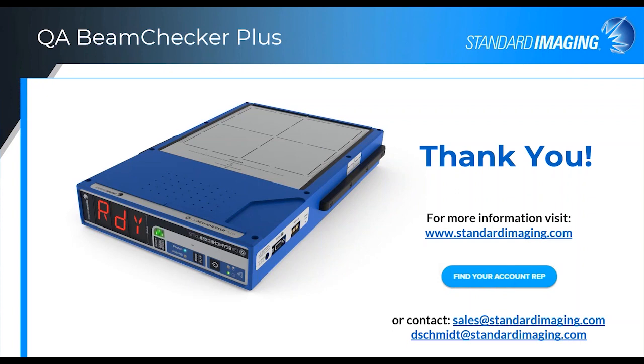We have had customers that have not baselined it for a very long time. Which I guess surprised me a little bit, but maybe modern Linacs are that stable. But I would say typically the decision would obviously be up to the physicist, but typically people are doing it on about a 6 to 9 month basis.